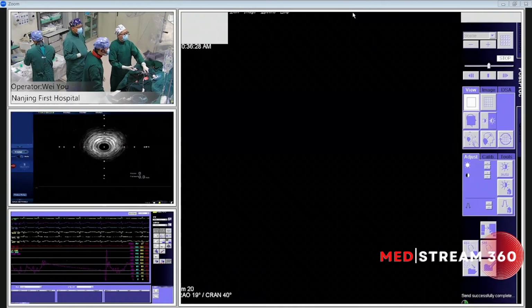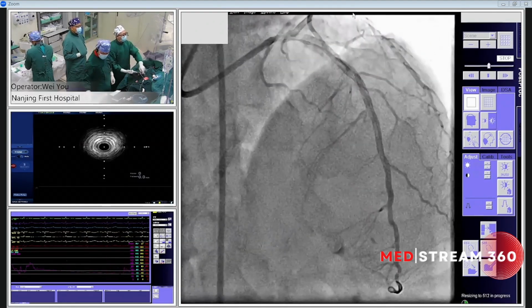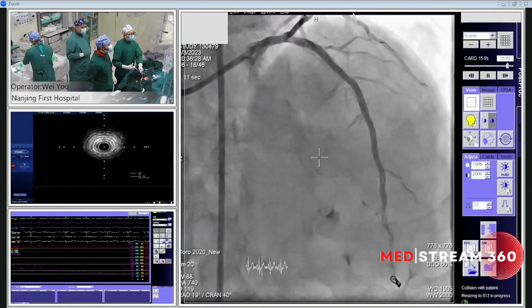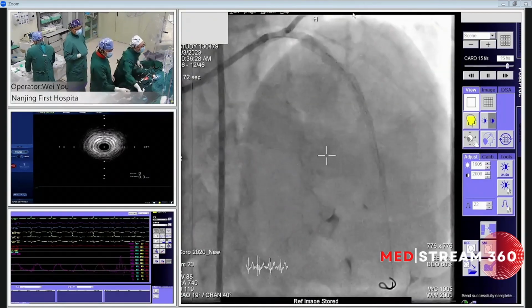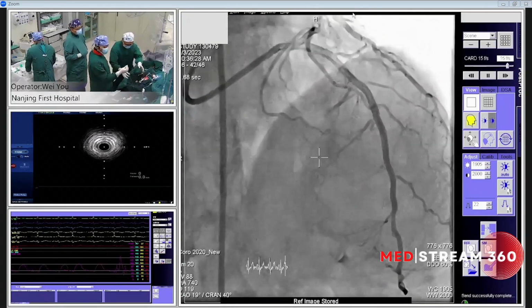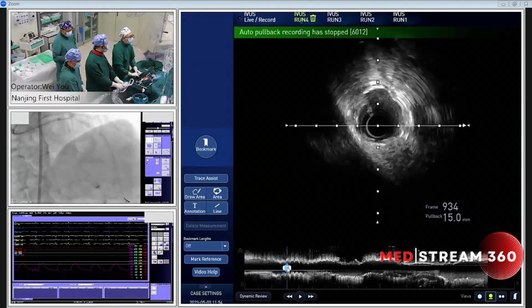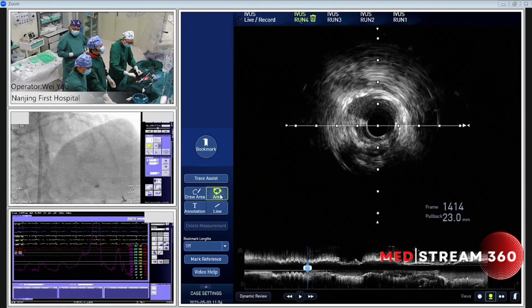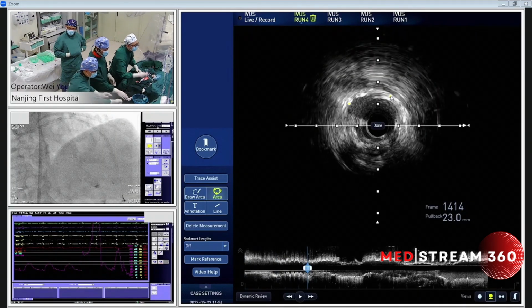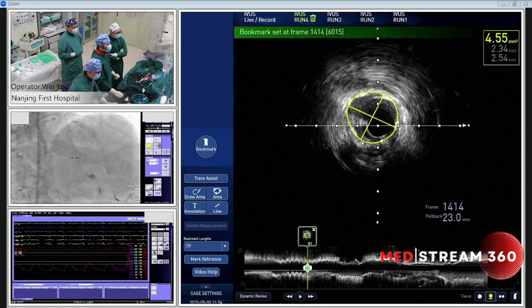The two diagonals are good, still there. The first, the second and the fourth diagonal. Good. So Chief, we will check the IVUS. Please do the analysis of the IVUS image to tell us if we have achieved the optimal ULTIMATE criteria. So Dr. Pan, please.